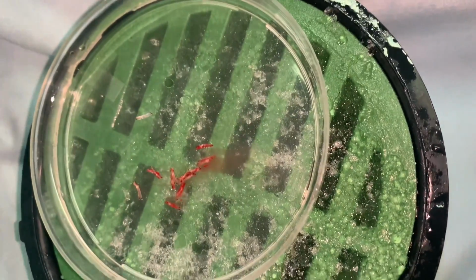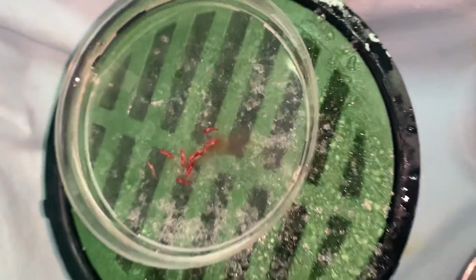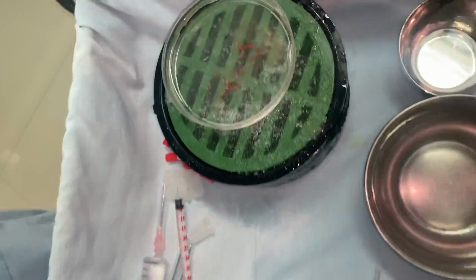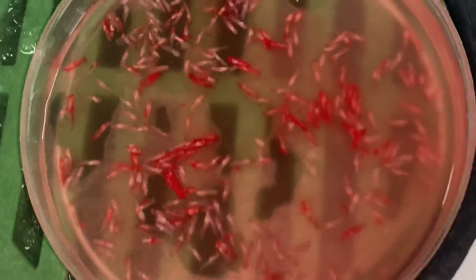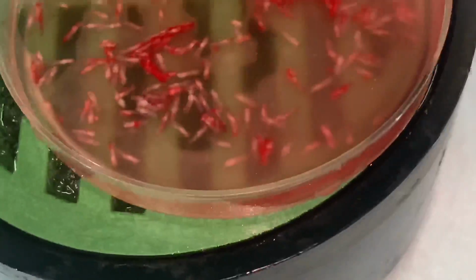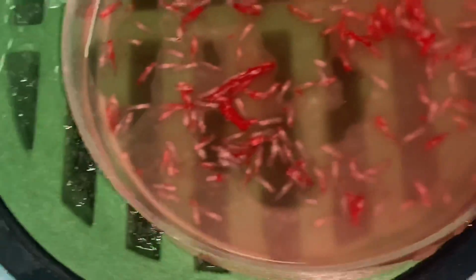And you can hear the sound of the motor. The process of harvesting more follicles goes on while this team is sorting out the follicles and placing them in the right container. So that's all the follicles that we've got. We've gotten a little more than what we need. Obviously that's safer because we don't want to go and harvest again.